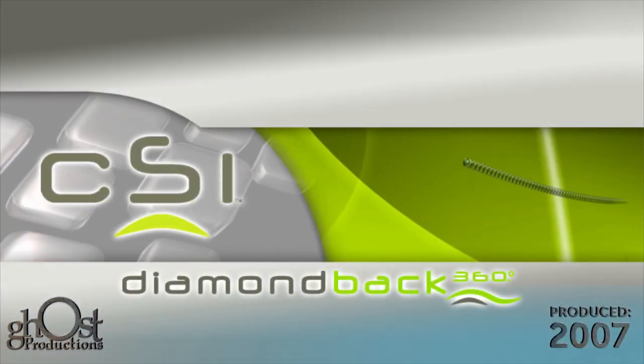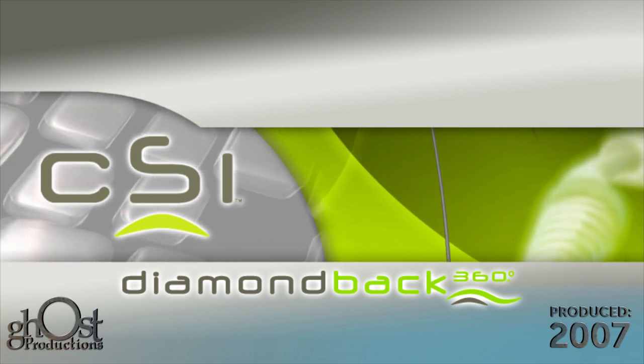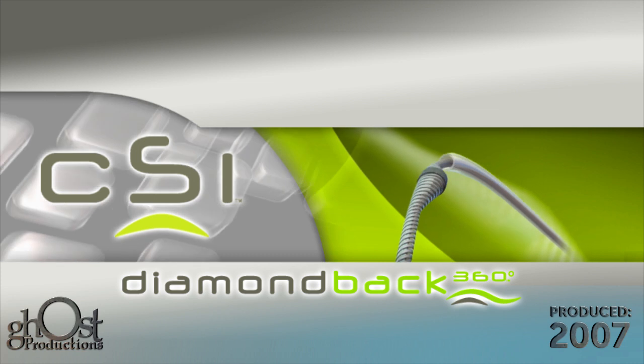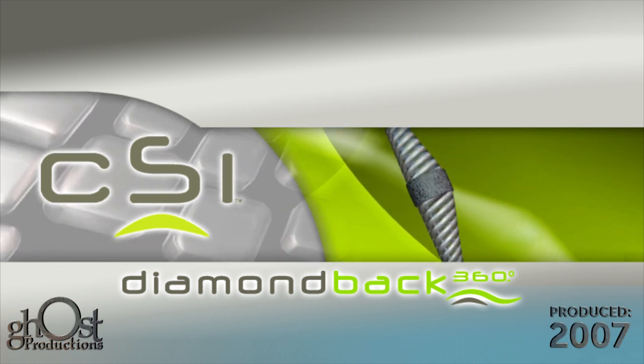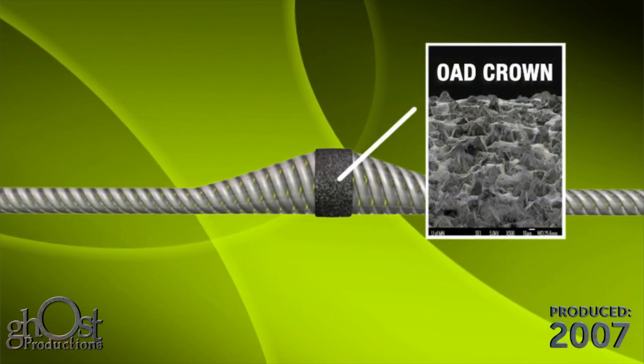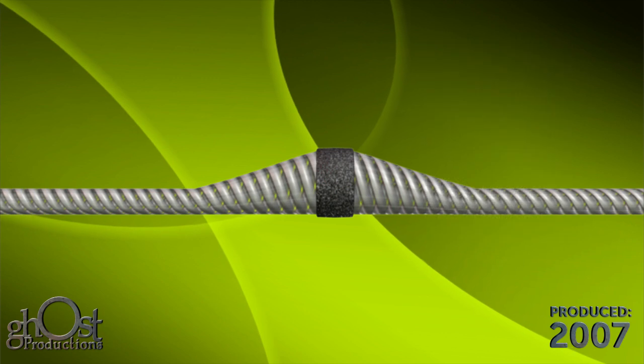The following is a demonstration of the CSI Diamondback 360 Orbital Atherectomy System for treating peripheral artery disease. The Diamondback 360 device utilizes an eccentrically shaped crown embedded with diamond chips, which gradually sand away plaque including complex plaque morphologies and calcified lesions.